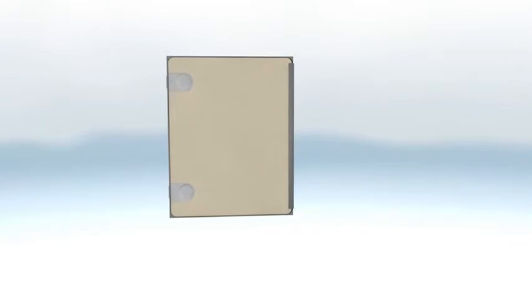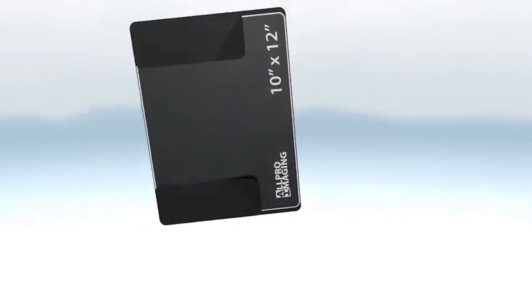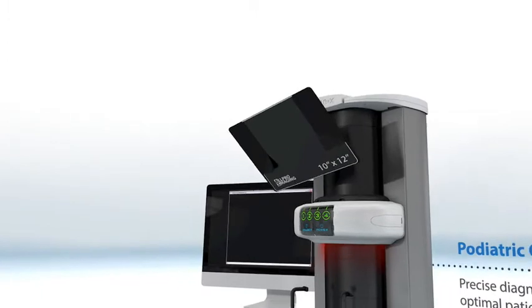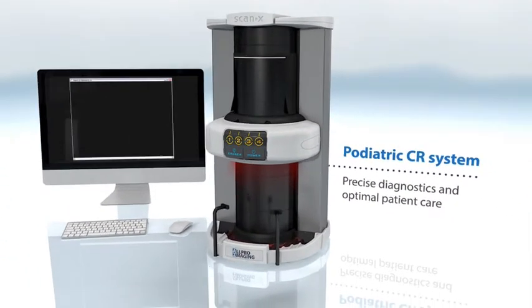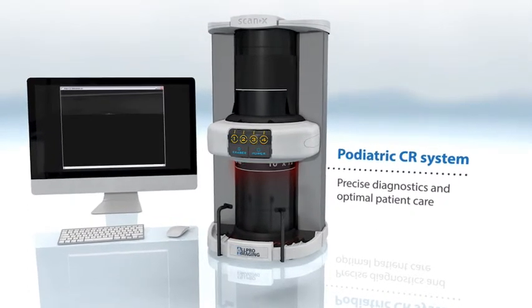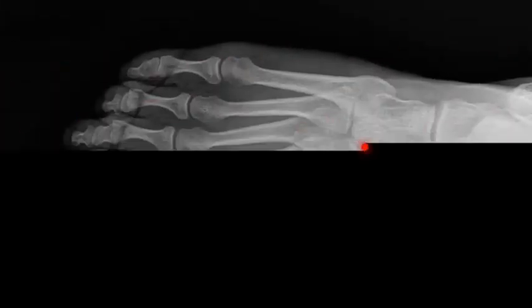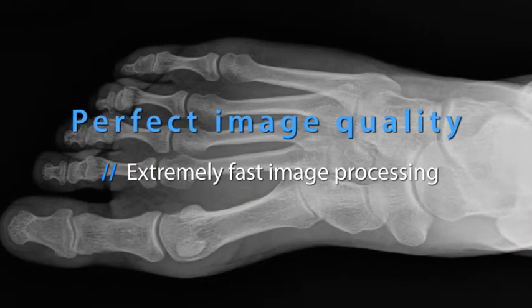Once the plate is exposed, remove the plate from the cassette and process it through our patented ScanX 12 SE CR scanner. As the plate passes through the scanner, the latent image is processed into a digital image that will allow you to enhance, alter, and label your digital X-rays. It takes less than 25 seconds for the plate to be processed before your images are ready for further refinement to your liking.